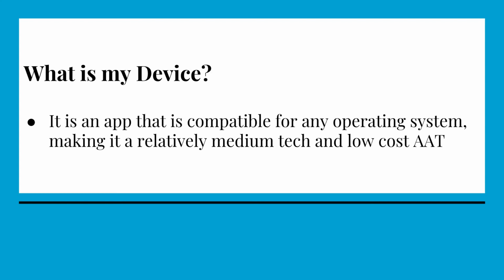The only drawback I could see is that because it is an app, it probably has a size limit. So I can see why there are things like the Dynavox that are a completely different device on their own, because they have a big job to do, with a lot of messages and information to store. I don't know if this app is actually possible, but I think it's a pretty cool idea.